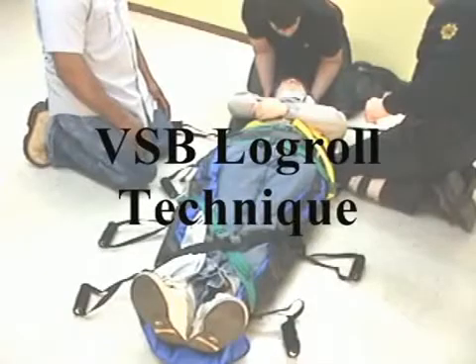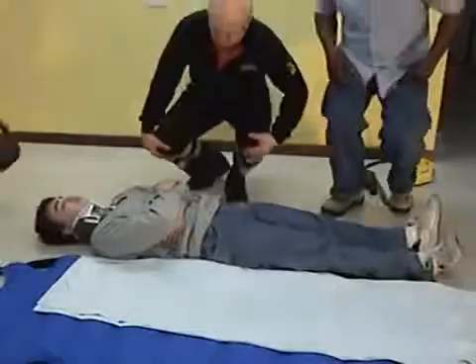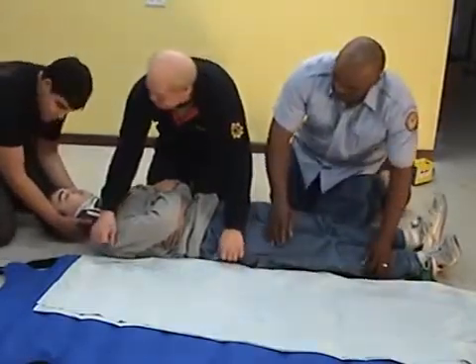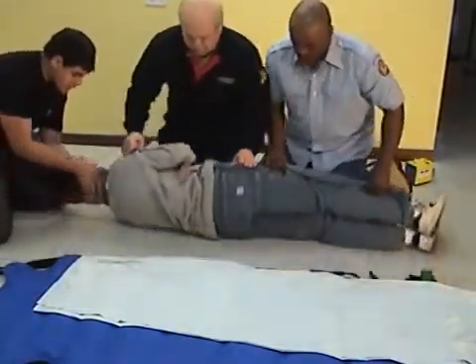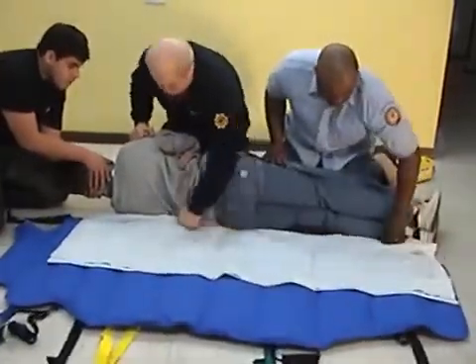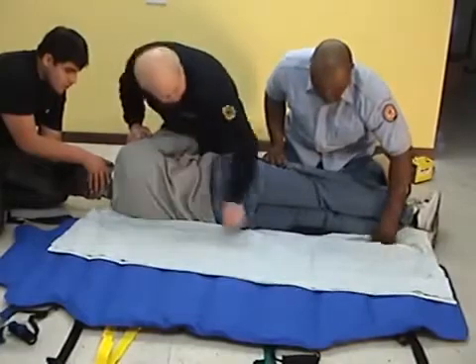Remove the VSB from its carrying case and unfold it. Lay it beside the patient and open up all buckles for the straps. Make certain that the handles and the pelvic strap system are in place outside the VSB, not under the VSB.